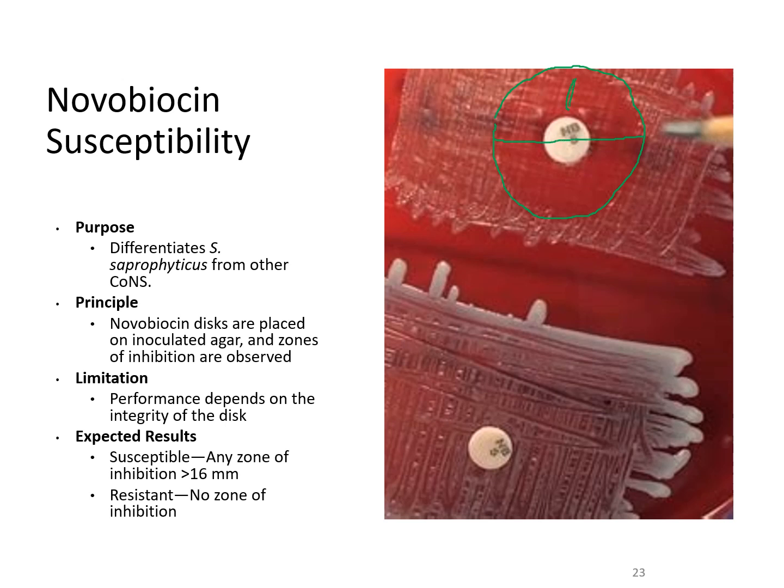And these little marks here are just the culture streaks. That's not actual growth, so you can see the more cloudy edges where that organism is actually growing. And so if you measure from one side to the other with that growth pattern, greater than 16 millimeters is considered susceptible or sensitive. And then if you have growth all the way up to the disc, then that is resistant.